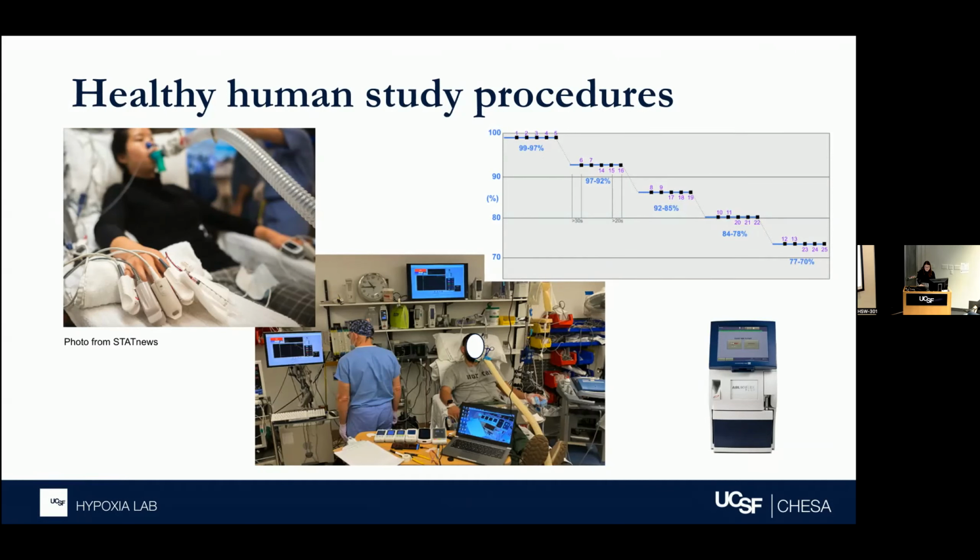But it's always a positive value, so it can't indicate whether SpO2 is negatively or positively biased for SaO2. And in order to meet FDA standards for pulse oximeters, devices need to have an ARMS of less than or equal to 3. And then skin pigment measurement is collected in the same way as described earlier, both subjective and objective measurements.